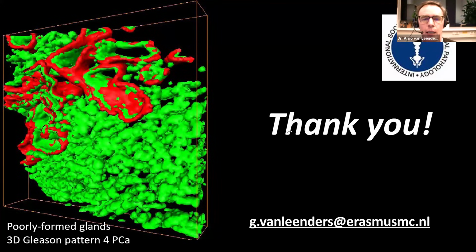If I don't know whether I'm looking at IDC or invasive cribriform, I would just mention invasive cribriform and/or IDC, and not distinguish between them. The presence of any cribriform pattern is already bad news. It doesn't matter whether it's IDC or invasive. Yeah, I think there's still a lot of work to be done in our understanding of that.